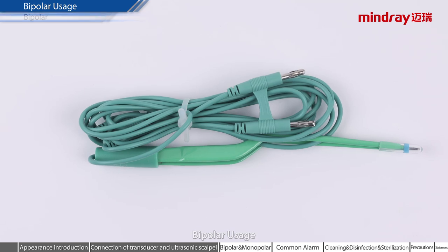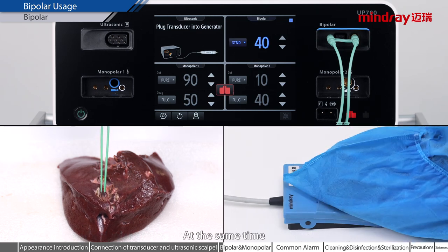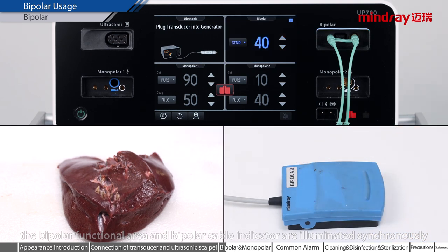Bipolar usage. Press the foot pedal to activate the bipolar coagulation function. At the same time, the bipolar functional area and bipolar cable indicator are illuminated synchronously.